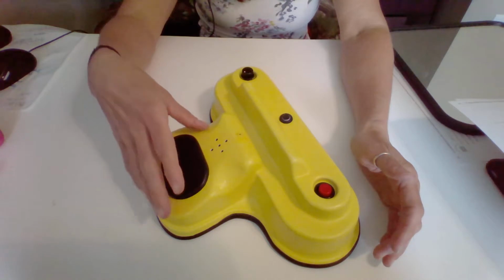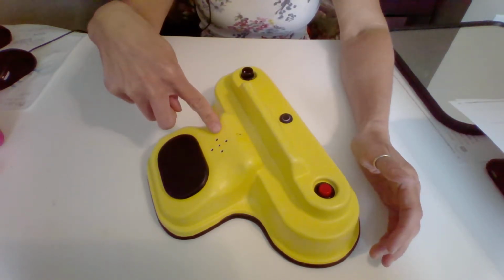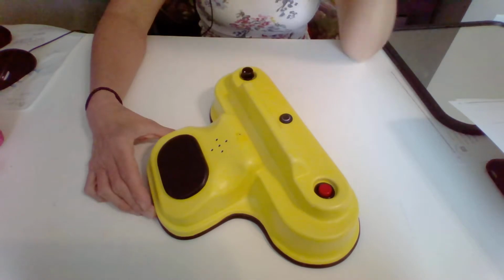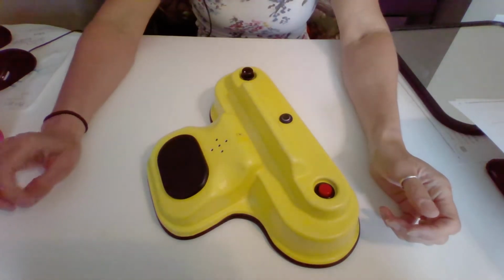This will record up to 20 seconds of any kind of speech or sound. So 20 seconds, it's a good amount of time. You know, so that's something to think about.